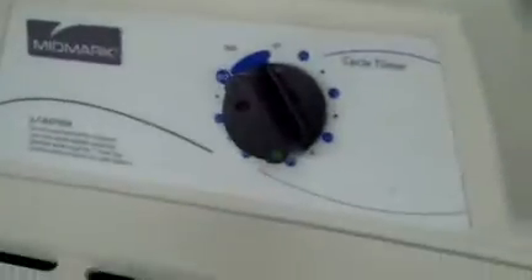It's in excellent cosmetic condition. Powers up without any problem — you can hear it running there. Open it up. Just threw a pair of tweezers in there. You can see it doing its thing.